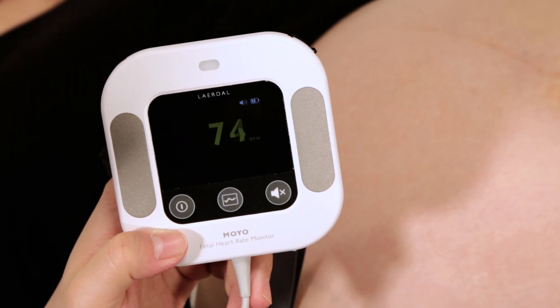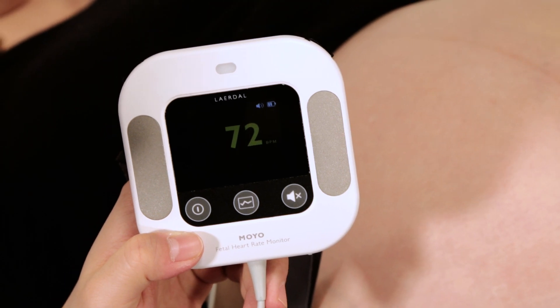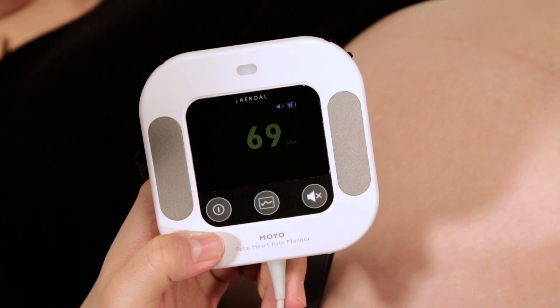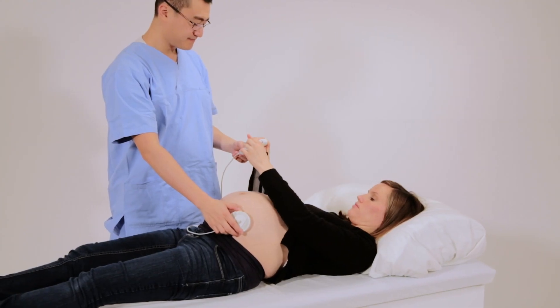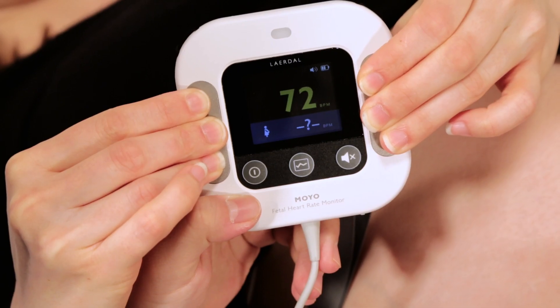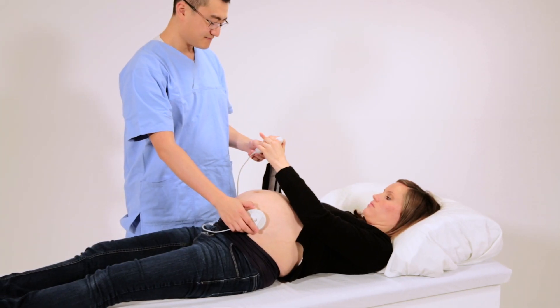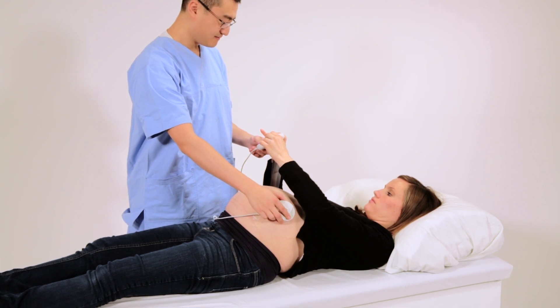In cases where low fetal heart rate is detected, the heart rate can be compared with the mother's heart rate by placing her fingers on the maternal heart rate pads located next to the display. If the heart rates are similar, move the ultrasound transducer to verify the fetal heart rate.